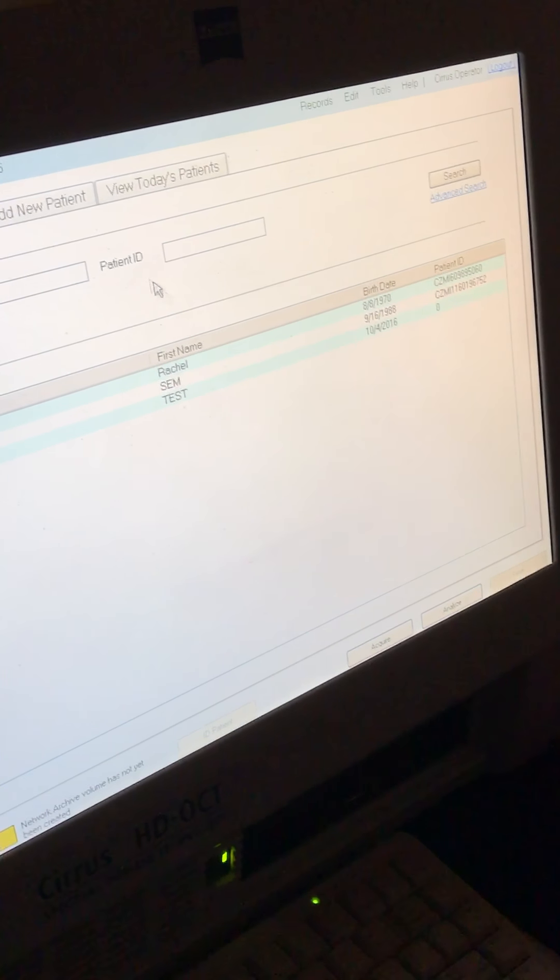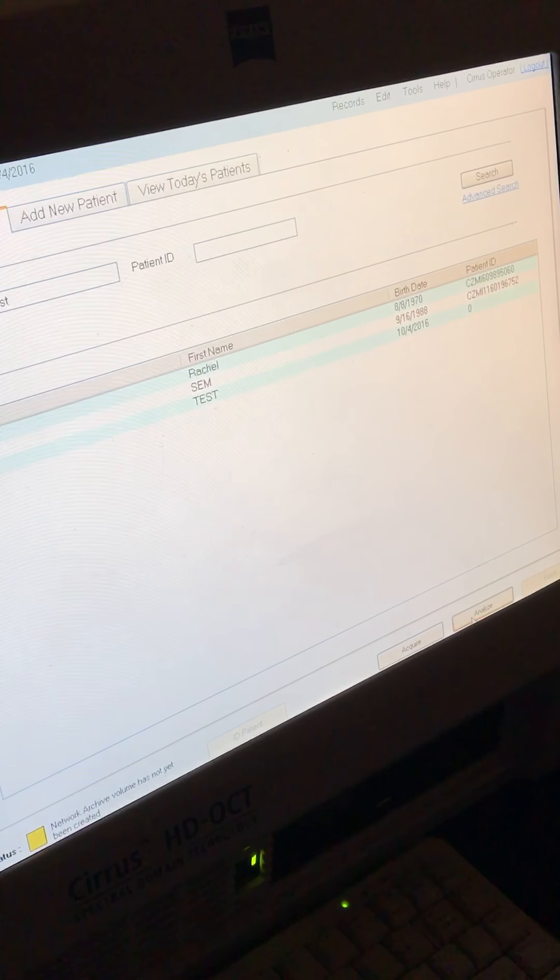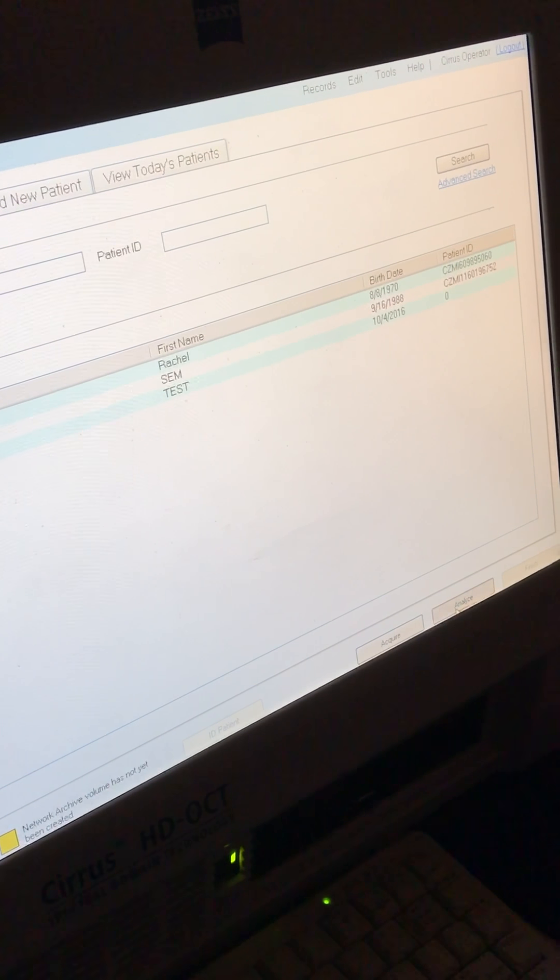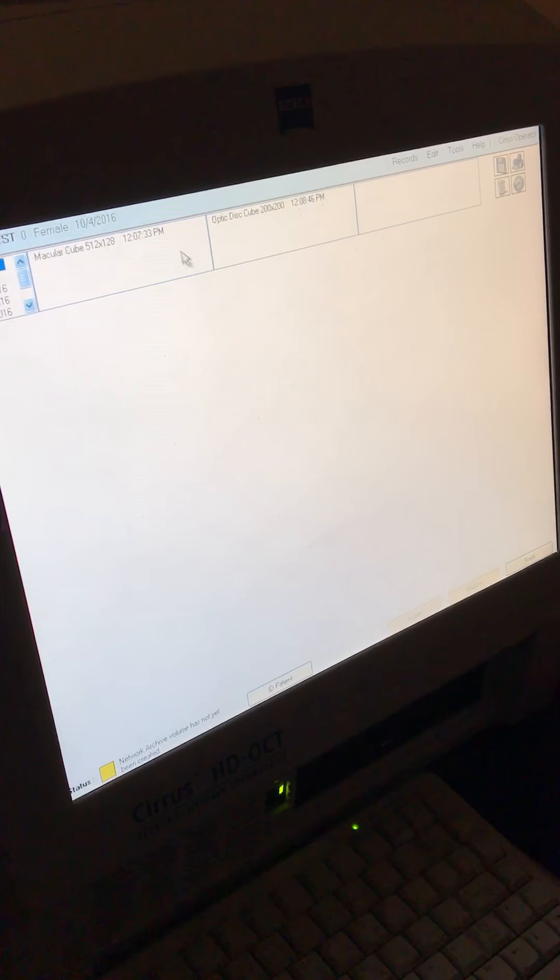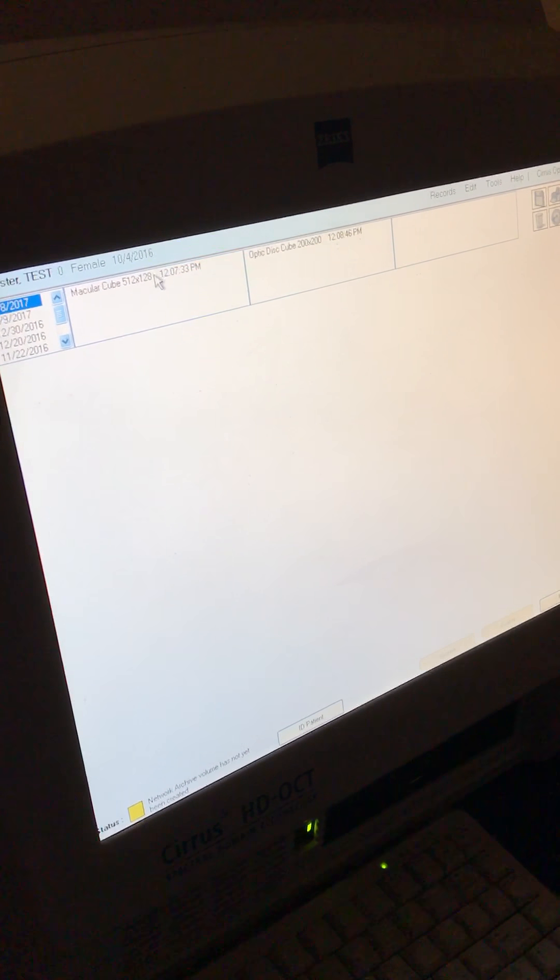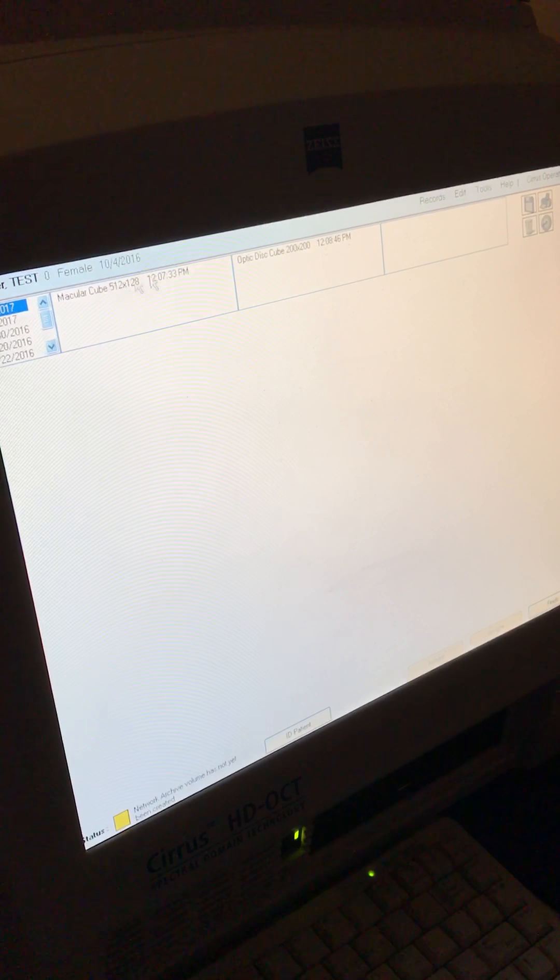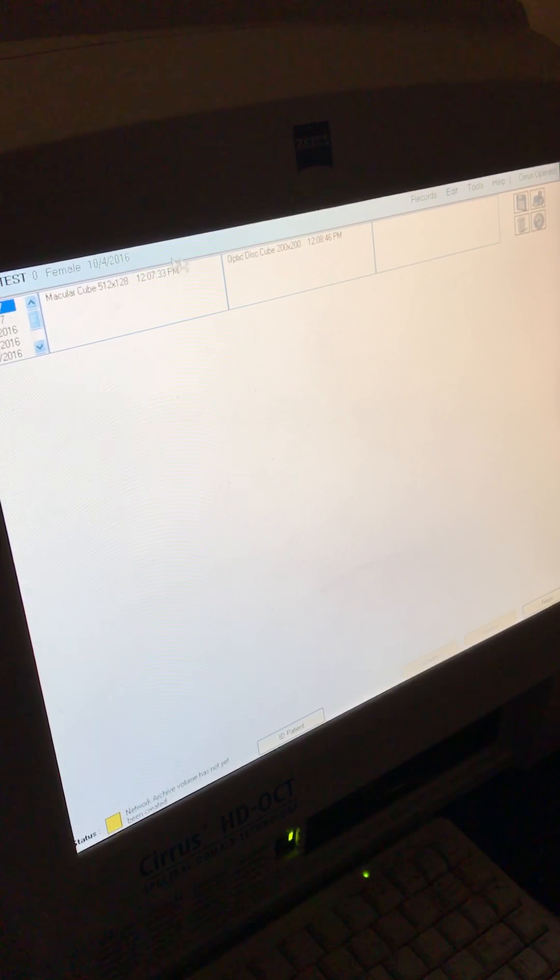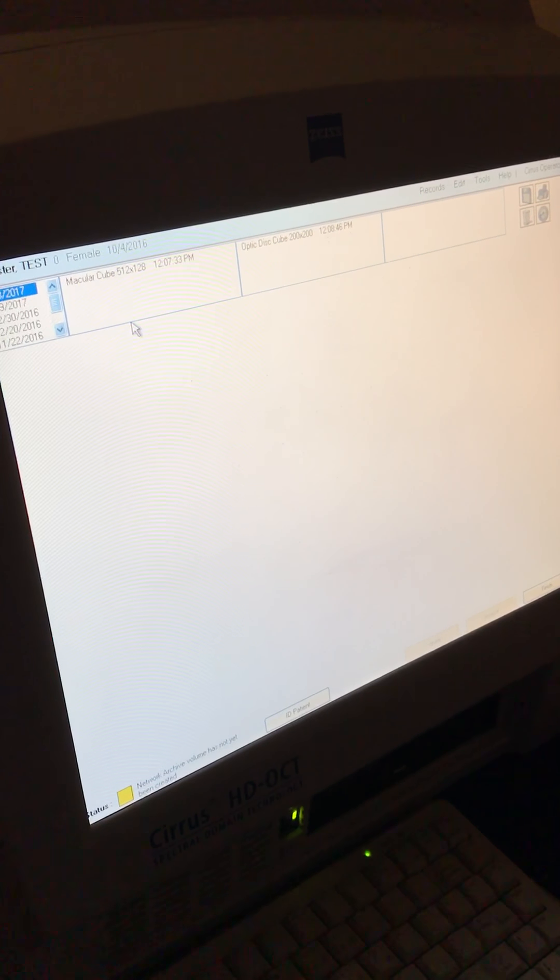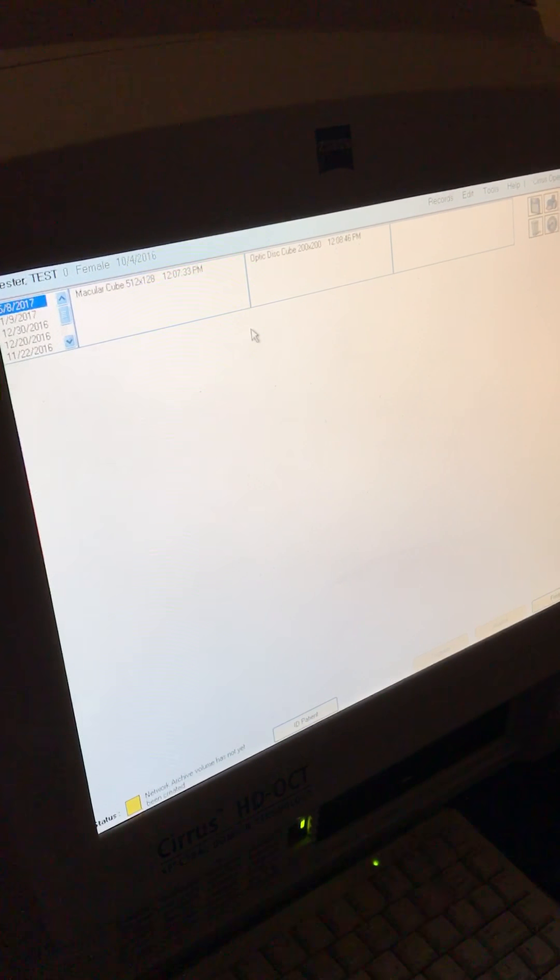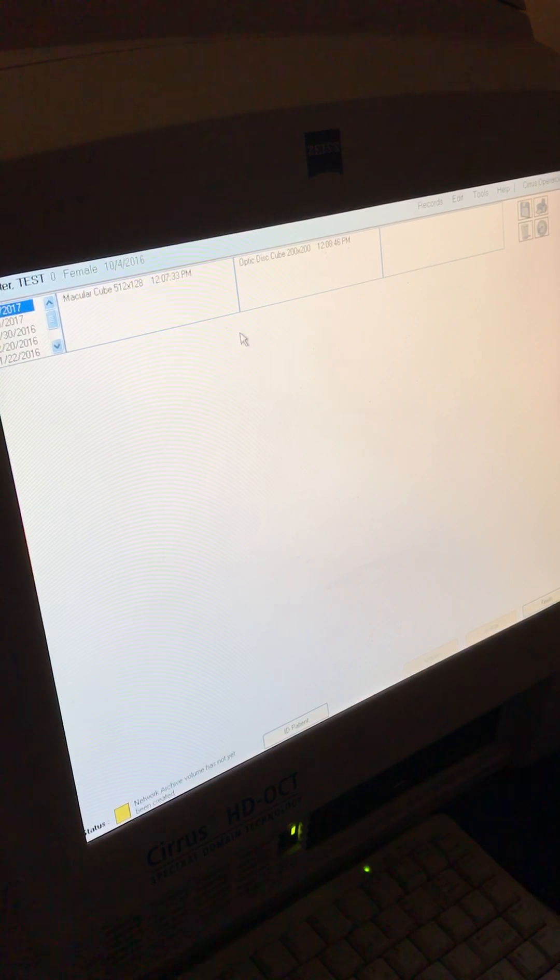And then to save, we'll go to analyze. And then from there, you can click on whatever test you did. And then you can either print them or upload them to the digital images drive.